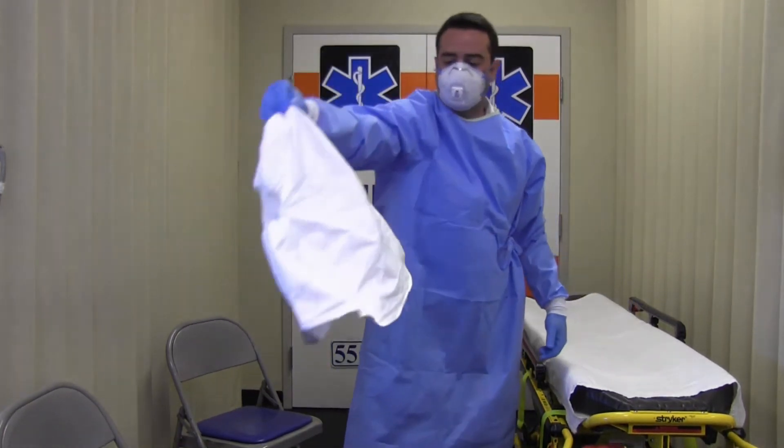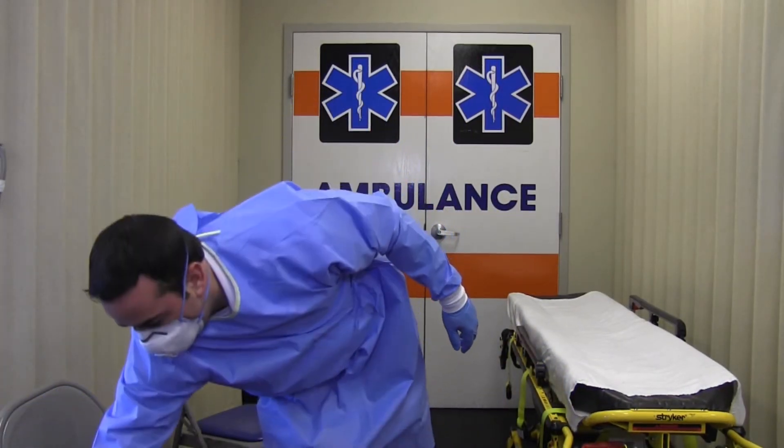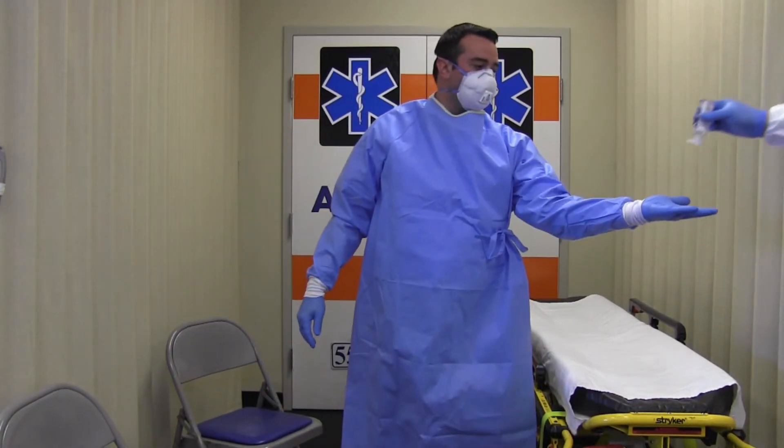Next you'll remove your surgical hood. Gently remove and discard. You will then disinfect your inner gloves with an alcohol-based hand rub.